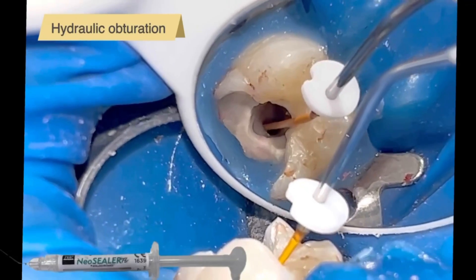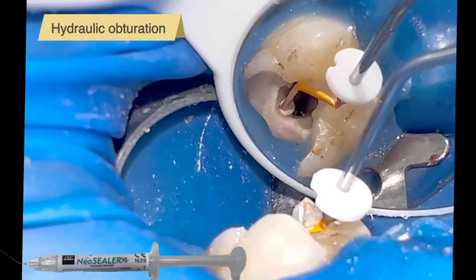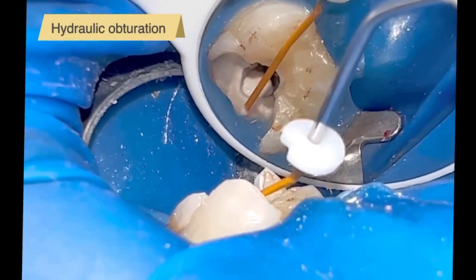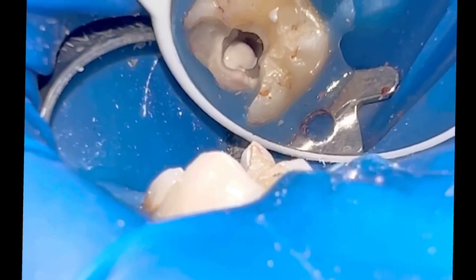Normally I always fill with continuous wave of heat in C-shaped molars. However, I have preferred to perform hydraulic obturation with bioceramics because it has an apical stop of 60.